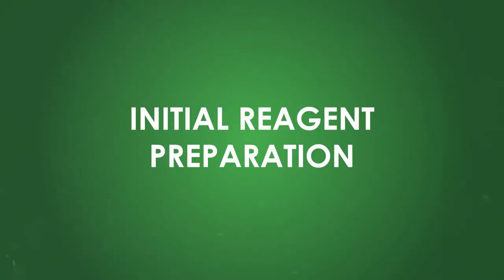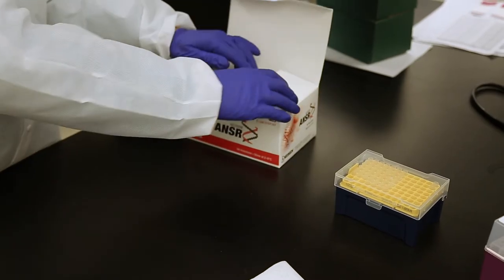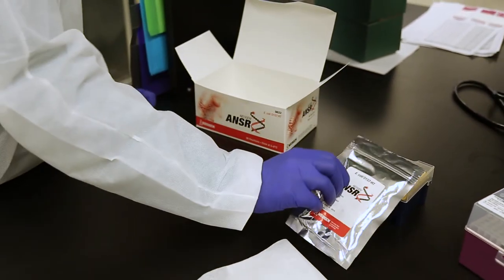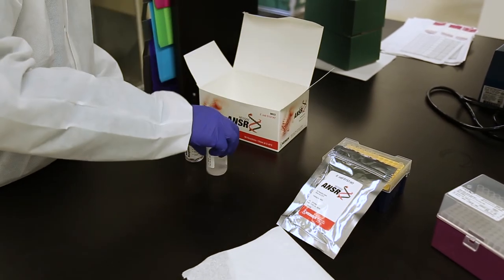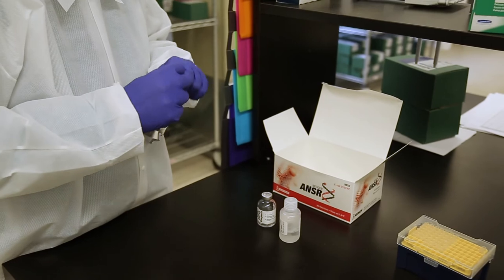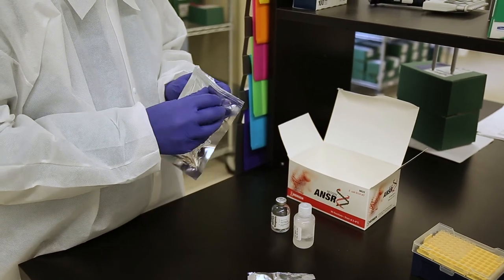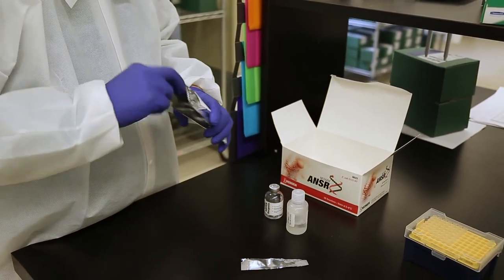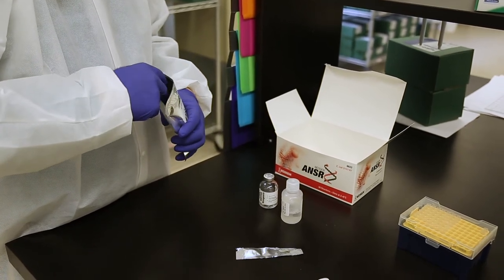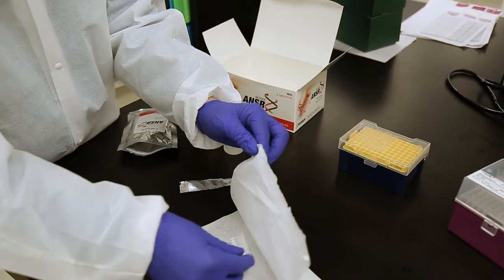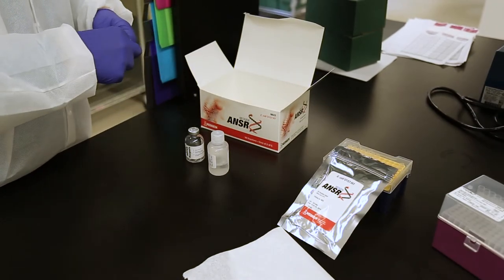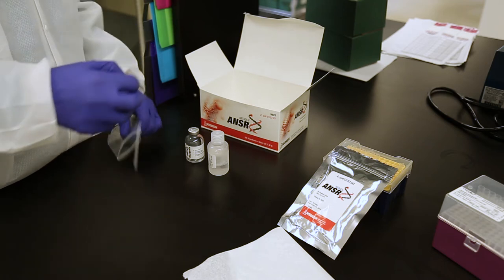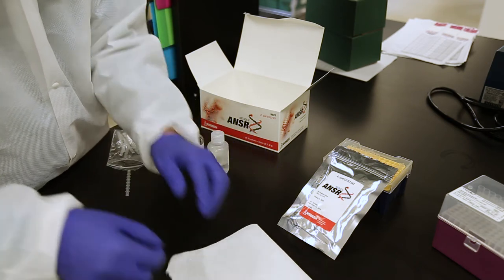Initial reagent preparation. Prior to running the kit, the lyophilized lysis reagent, lysis reagent suspension buffer, and appropriate number of reaction tubes for the number of samples you're running need to rest at room temperature for at least 15 minutes. We are running eight samples today, so we've removed one strip from a foil pouch and placed it under a paper towel to protect the samples from excessive light exposure. You should also place one set of permanent caps under the paper towel at this time. Unused supplies should be returned to refrigeration immediately.